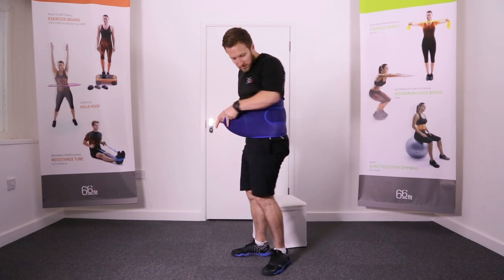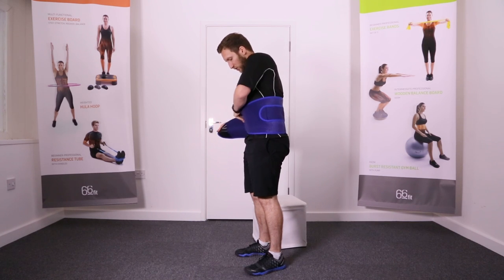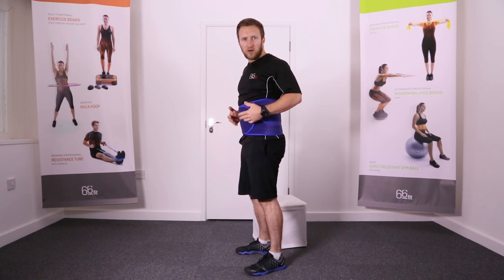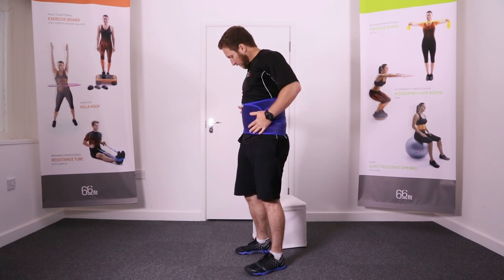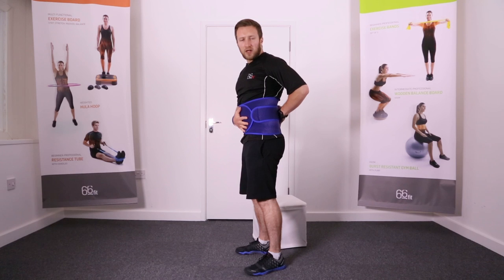To put it on, it's super simple and straightforward. Pass it around the back, make sure it's in the middle of your back where those braces are, pull it round the front and then secure it in place. You want it nice and tight as it's obviously going to be providing lots of support. You've then got these extra attachments that you can pull around for a little bit of extra tension.